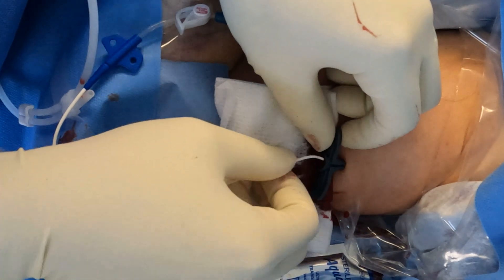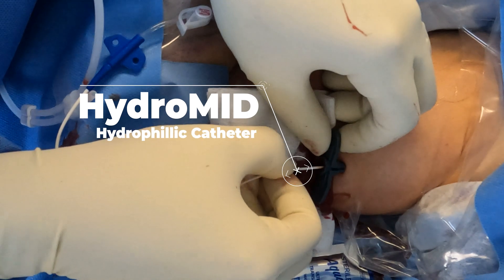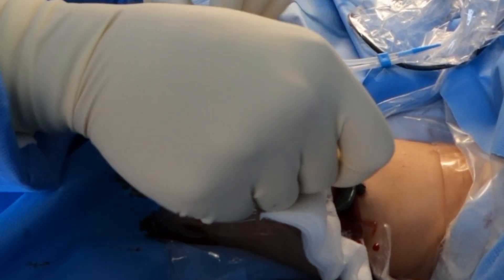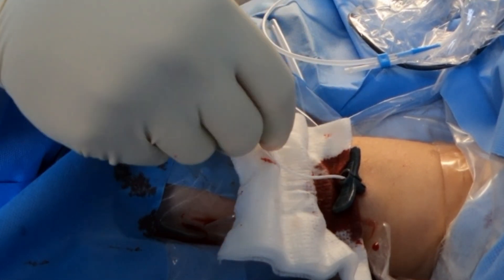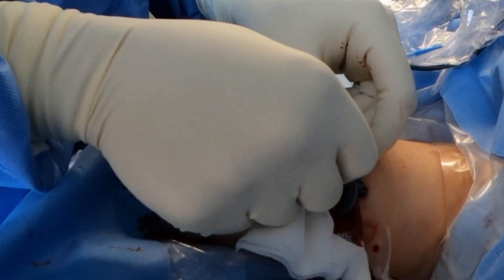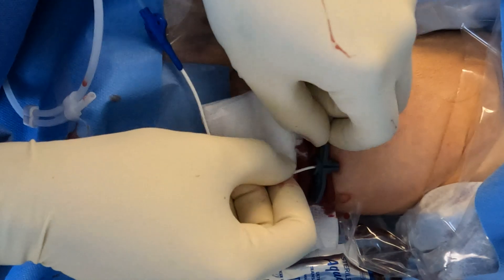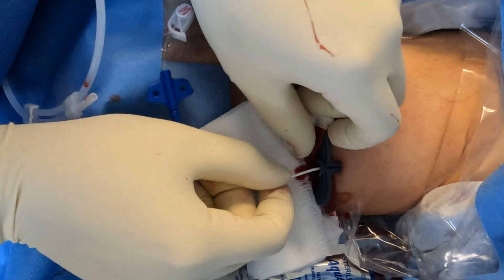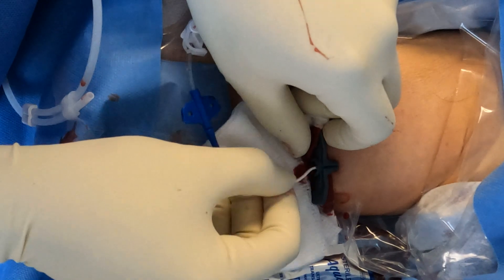Feel a little warm? That's just the blood — that was blood. There we go. Feeding it through. It's going nice and smooth, right up to here. There we go. Catheter's in.